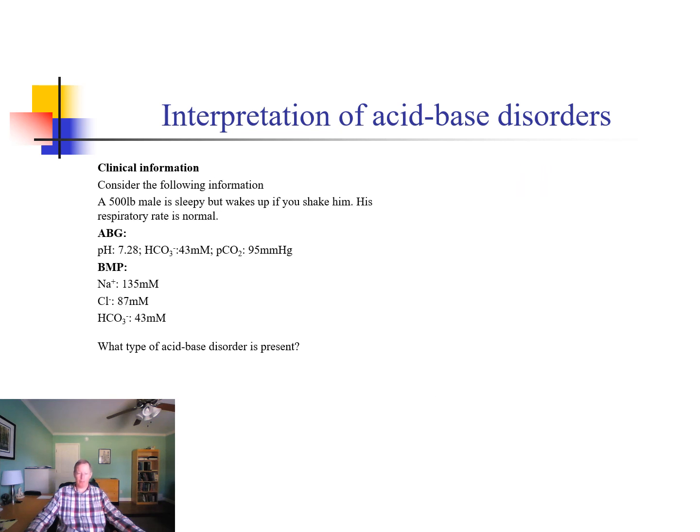Let's do this one. A 500-pound male is sleepy, but he wakes up if you kind of try to arouse him and shake him. His respiratory rate is normal. pH 7.28, bicarbonate 43, PCO2 of 95 millimeters of mercury with this BMP.